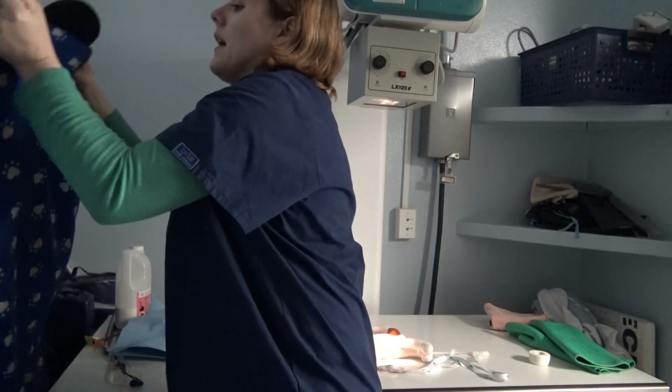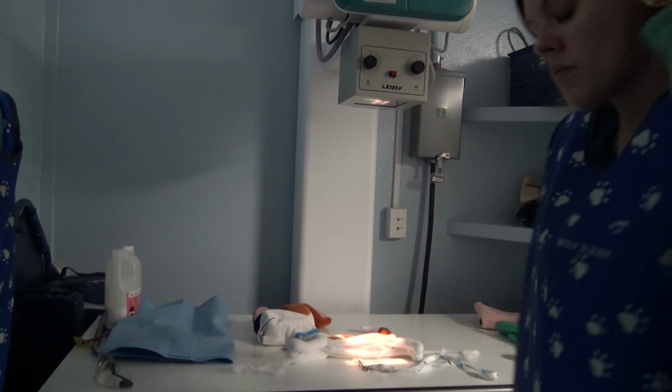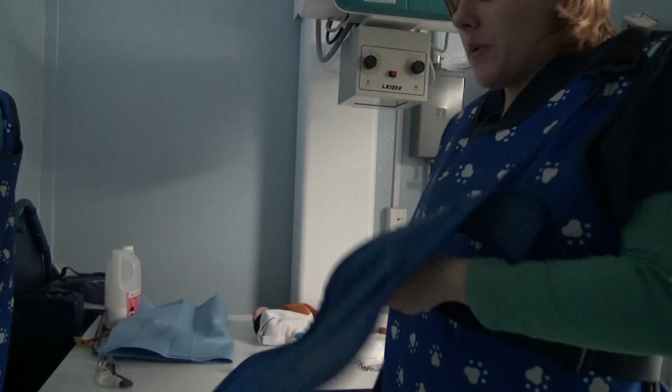I'm going to go ahead and gown up in my personal protective equipment.